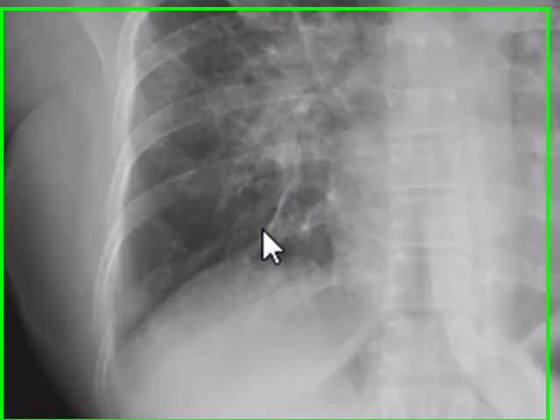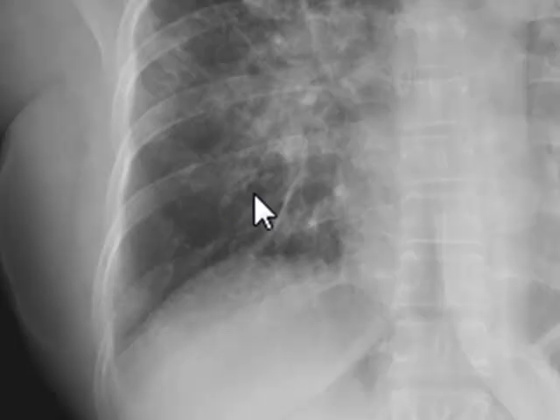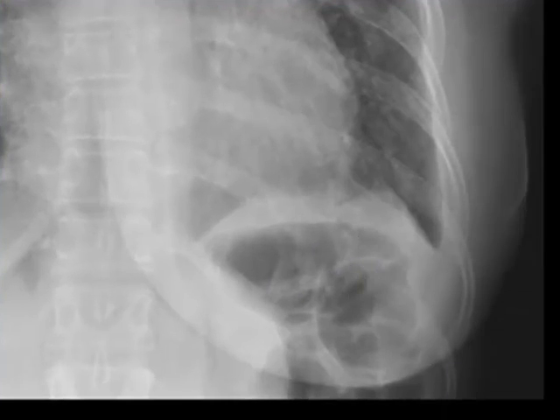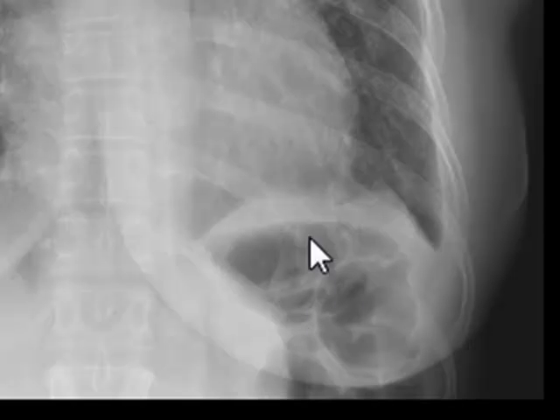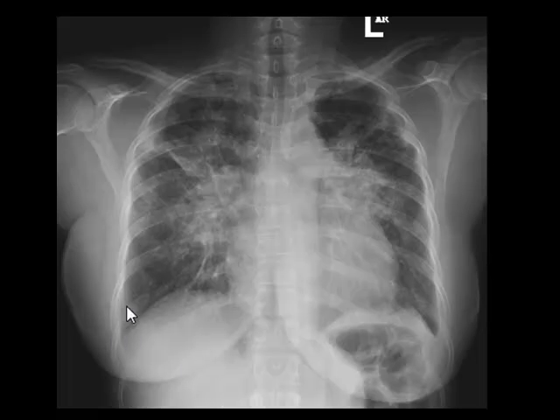There is an accessory fissure and an accessory lobe here — a normal variation. There is also gas in the splenic flexure of the colon, and the transverse colon is visible here. The right costophrenic angle looks normal.